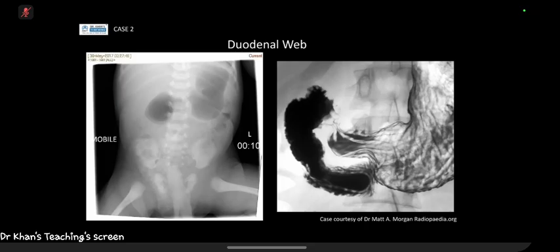Generally in these upper and lower GI contrast studies, we use water soluble, so Omnipaque 300 or whatever. I personally dilute for my lower GI studies, just because they tend to present more acutely obstructed and you don't want to do as much fluid shifting potentially. Barium we don't tend to use, because A, if they have to go to surgery, it makes it more complicated for the surgeons, and B, if you perforate whilst you're doing the study, it can cause a peritonitis. So barium is best avoided. Yep. Thanks, Toby.